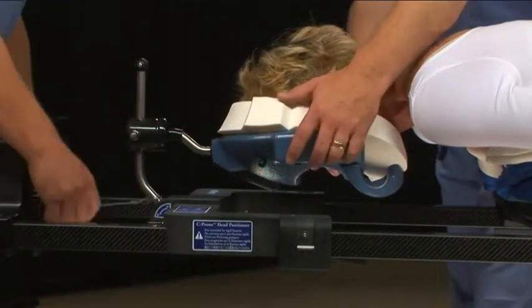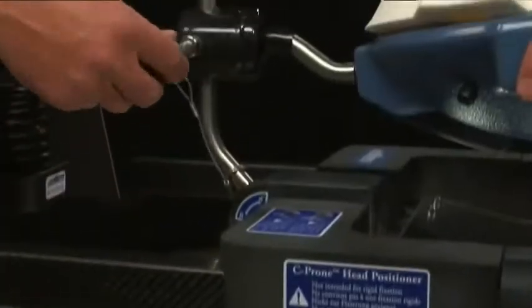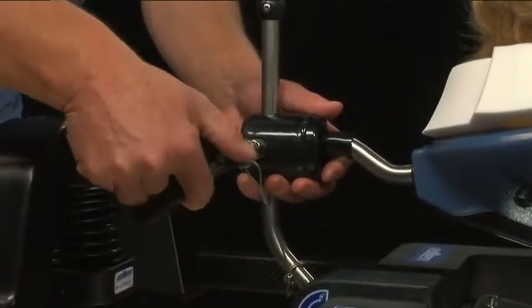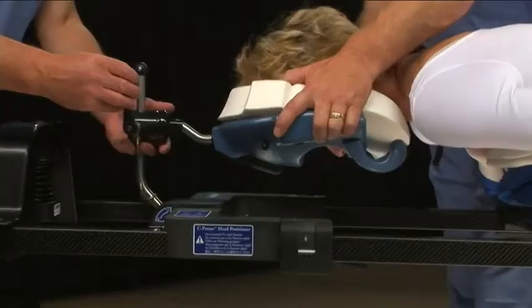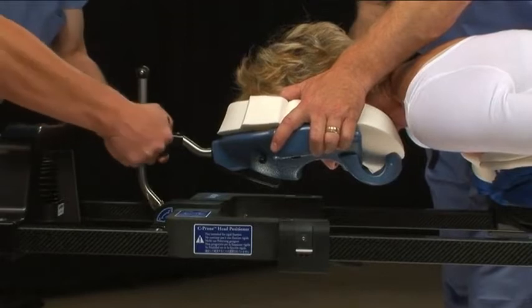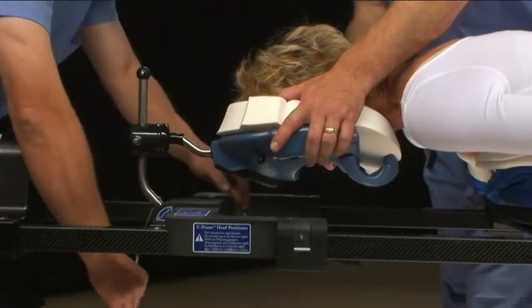One person should take hold of the mask. A second person should attach the handle and loosen the mask. After placing the patient's head in the desired position, tighten the handle and remove it from the stud so that the mask cannot accidentally be released.